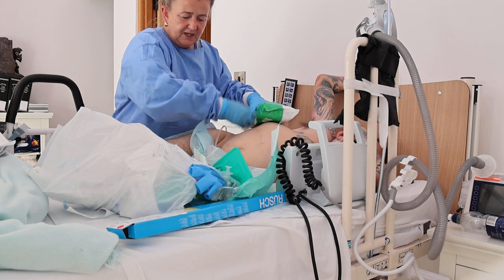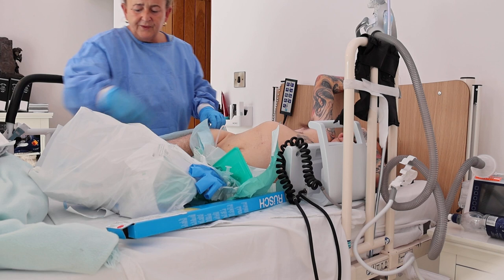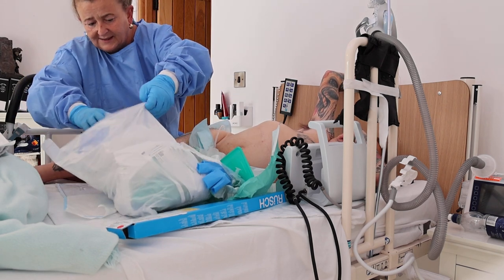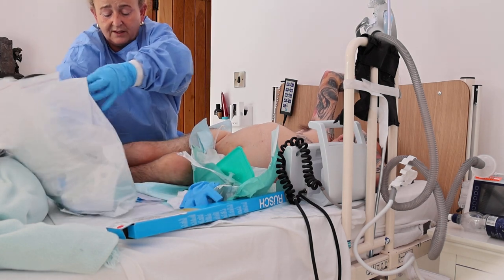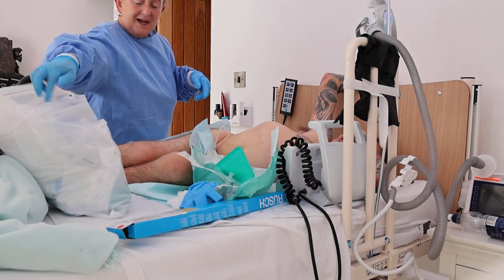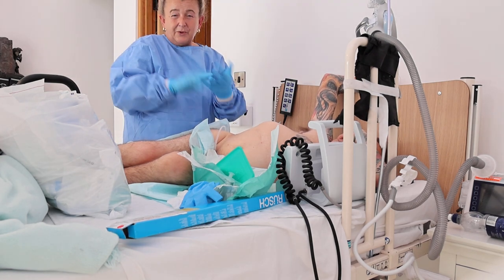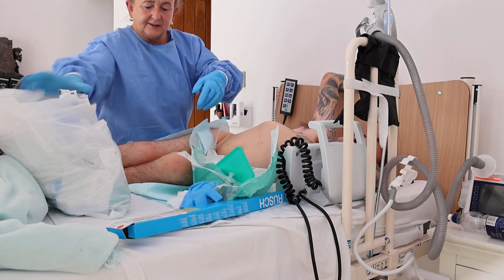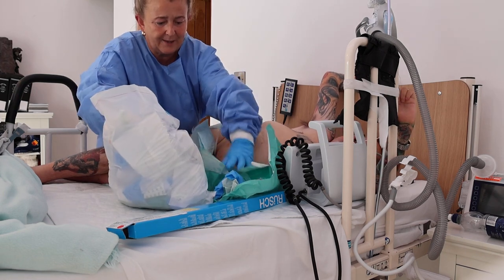I wipe as much as I can down as I go along, obviously, because of the infection that Ben has got. And the dipstick is in this bag somewhere, but you don't want to see that, and neither do I actually. It was disgusting, but you know what? This is a prevention of major AD, and it's preventing more infection, and it also prevents the double incontinence. It will stop now downstairs. I'm going to have a look to see if it has stopped. Yeah, it has.